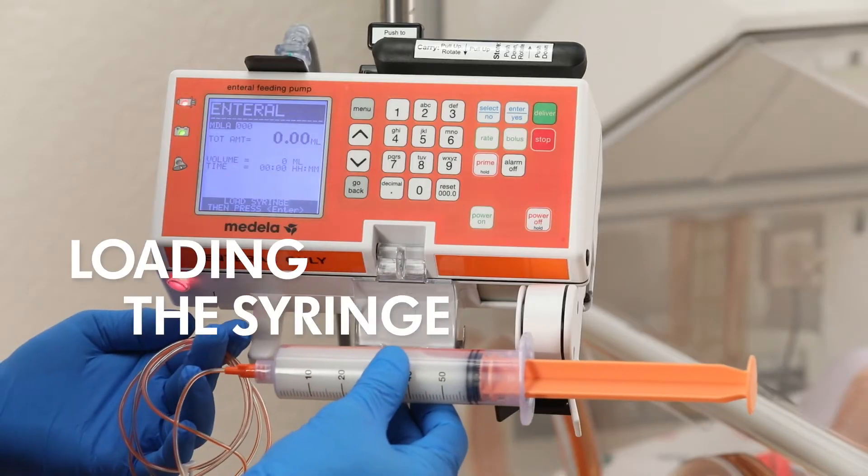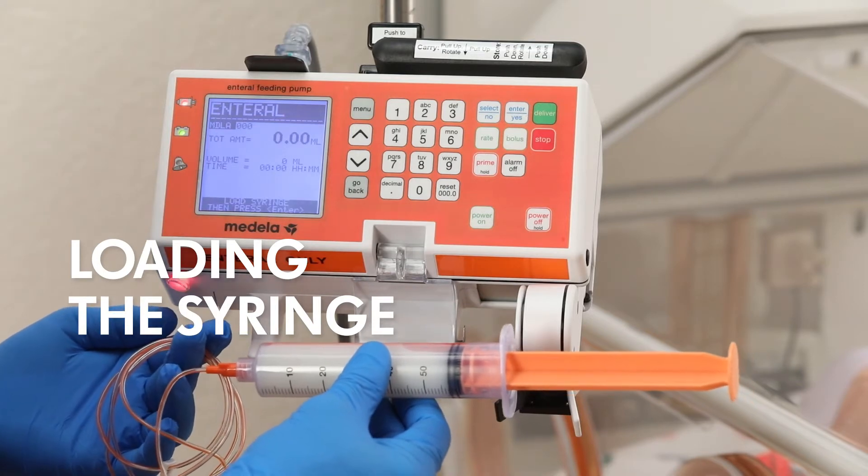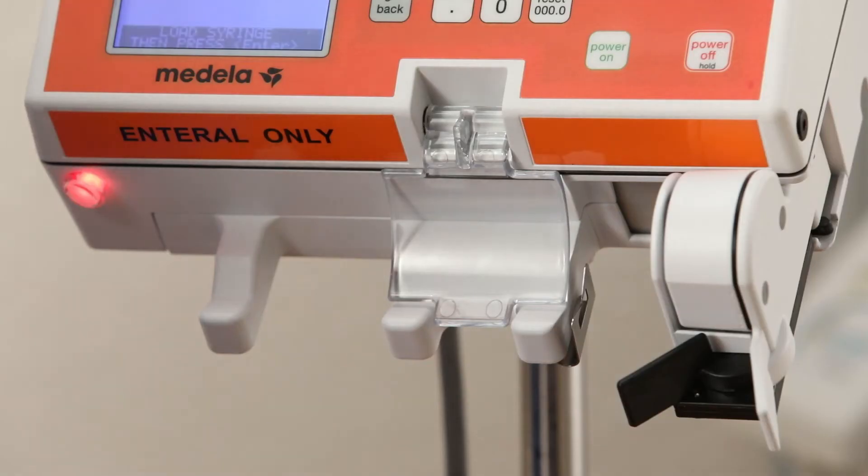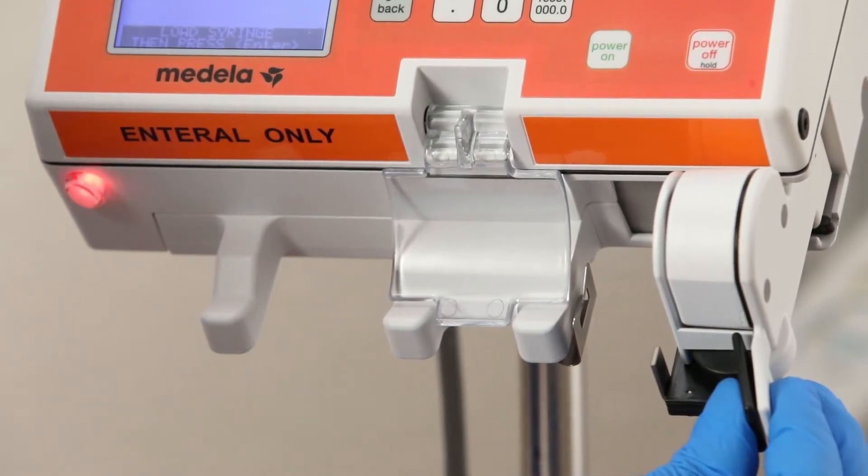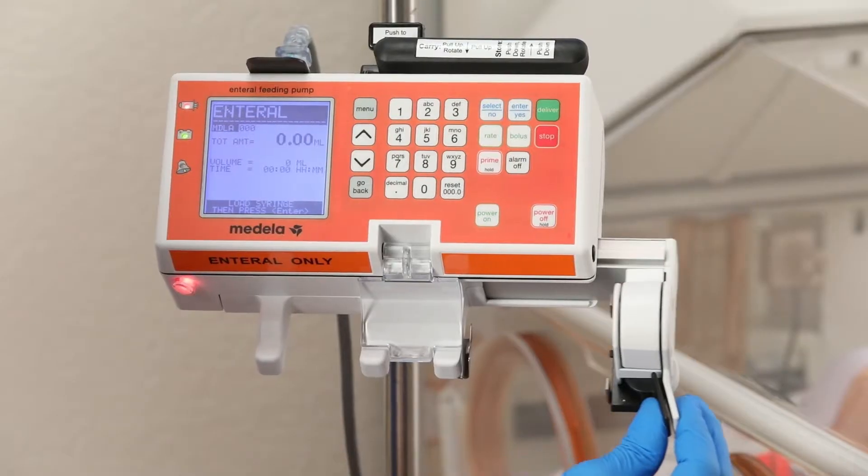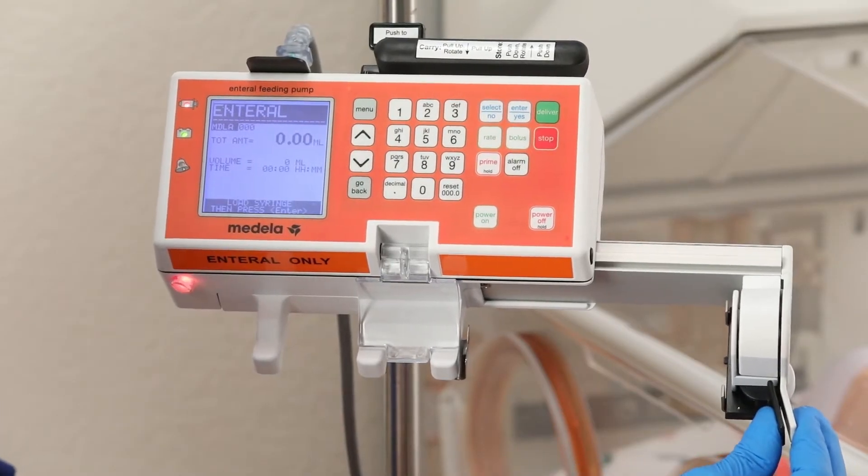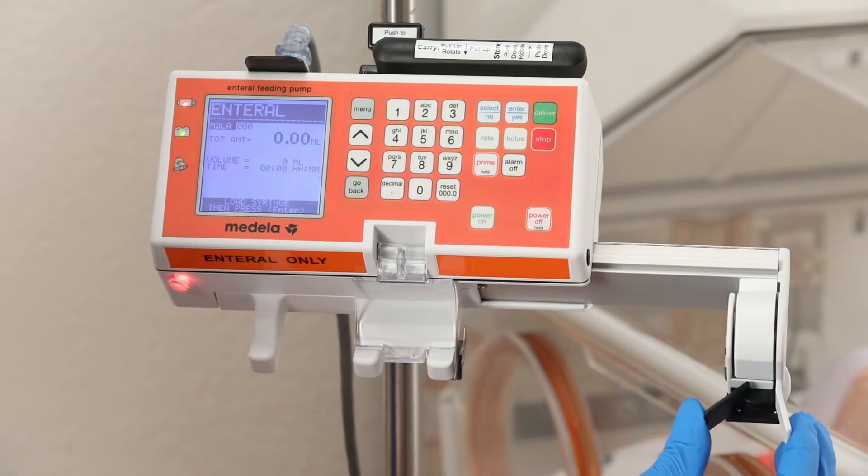Ensure you have securely connected the set before loading the syringe on the pump. To load the syringe, squeeze the black clutch lever toward the white tab. Hold the black clutch lever and the white tab tightly together to release the clutch. Slide the syringe driver to the right until it reaches the end of its travel and release the clutch lever.